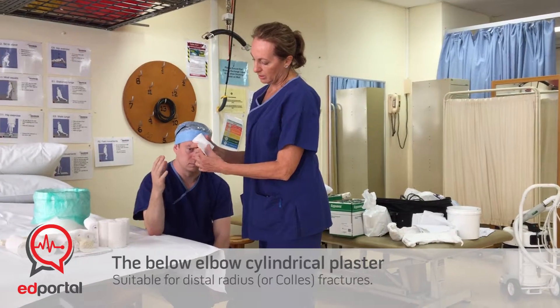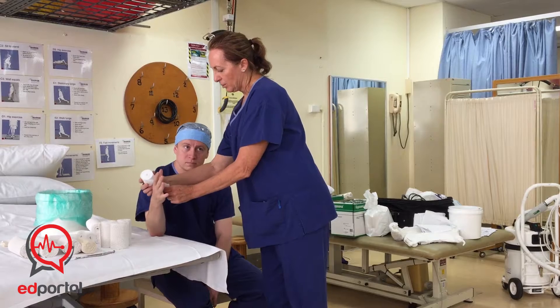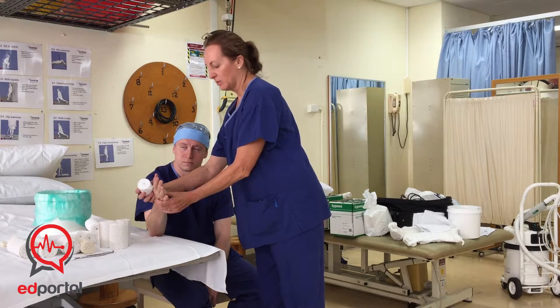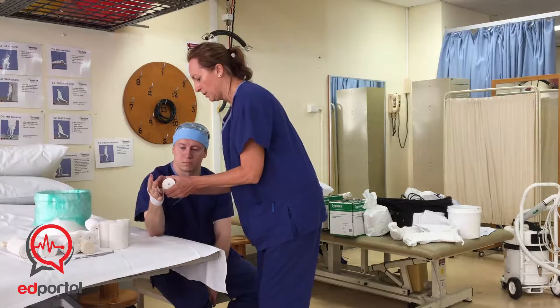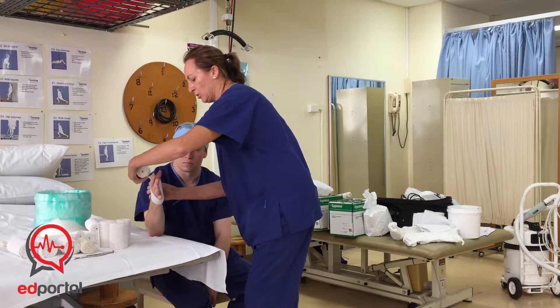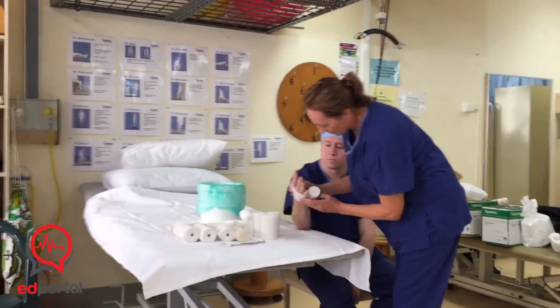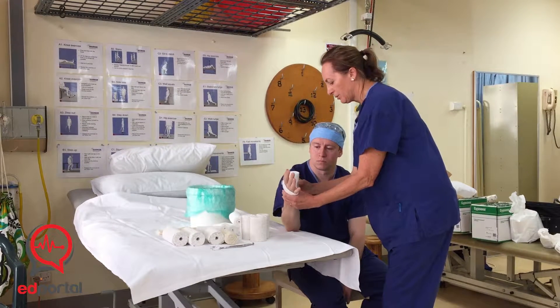Poke a little hole in the webbing two thirds of the way down, put it over the thumb and that anchors it. Now you can pull the webbing on fairly firmly. You can cut or tear bits that you want to wrap around. If you pull it on too firm it just tears, so we want it fairly firm.